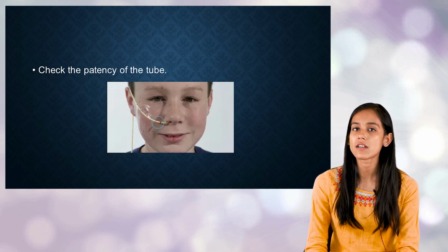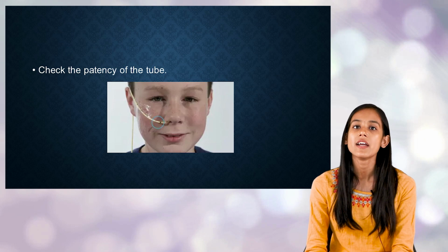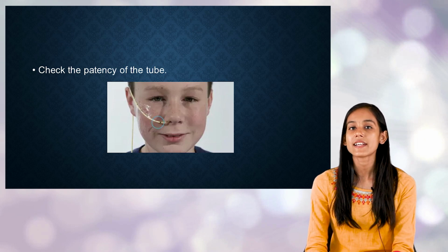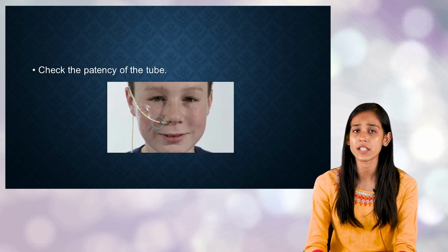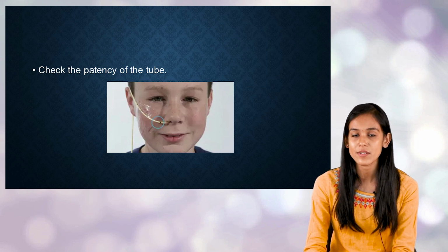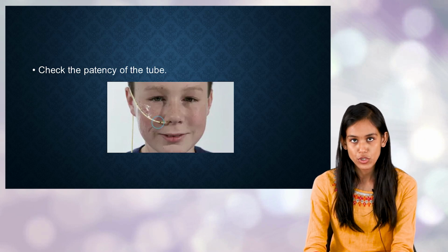If it does not reach the stomach and goes to the trachea, into the respiratory tract, then when you feed the child, the food or fluid contents would directly go to the respiratory tract, and the patient would choke, right?